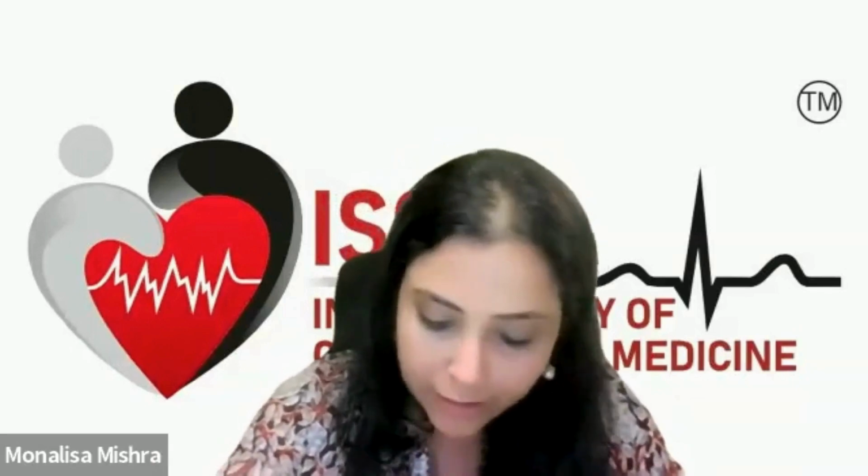So, as sir said, mainly to differentiate different types of shock, to assess volume responsiveness, for which sir has told that we should use PLR, and to measure aortic VTI, and the respiratory swing in the VTI waveform as well in patients who do not have any spontaneous respiratory effort. Apart from that, looking at the LV and the RV contractility and size, and looking at pericardial effusion. And of course, the last thing, the intracardiac shunts. So these are the main things we need to concentrate on when we are looking at cardiac sonography from an intensivist point of view.